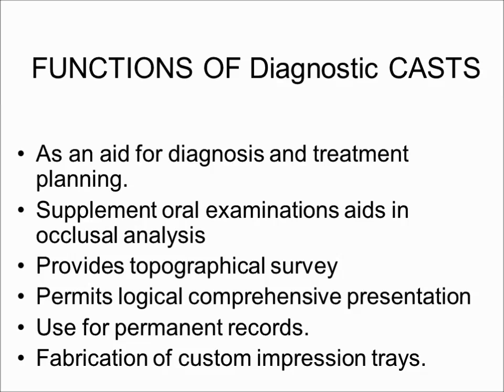Casts may be used to fabricate individualized impression trays, when such conditions exist that preclude the use of the standard stock impression tray. Casts become part of the record of treatment. Alterations are frequently done on duplicate casts.